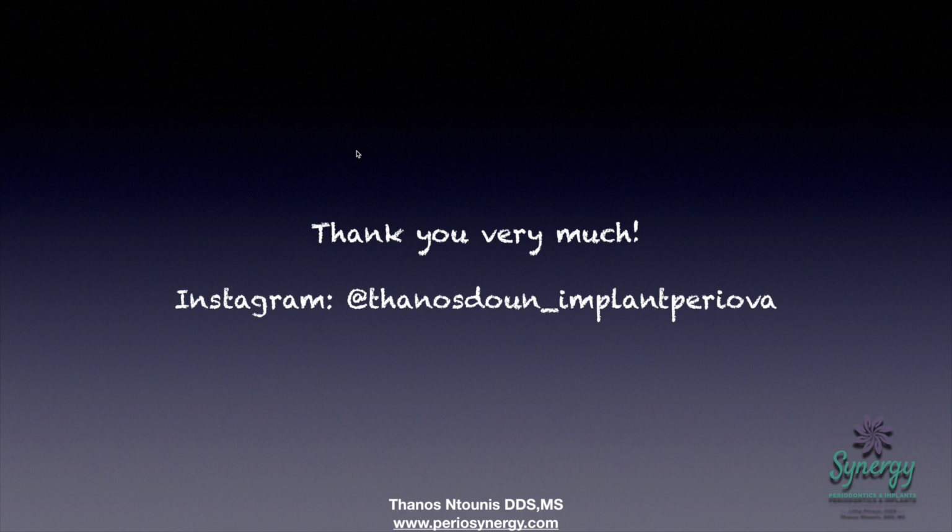And most importantly, changing the environment in which the restoration is to live for the next years. And we do that by using the patient's own tissue. Although in a case like that, many I think would have success even using allogenic dermal matrices, the connective tissue is still considered the gold standard.